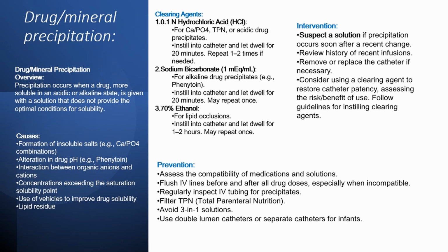Intervention. If you notice precipitation after a recent change in infusions, review the history and consider removing or replacing the catheter if necessary. Use a clearing agent carefully, following guidelines to assess the risks and benefits.